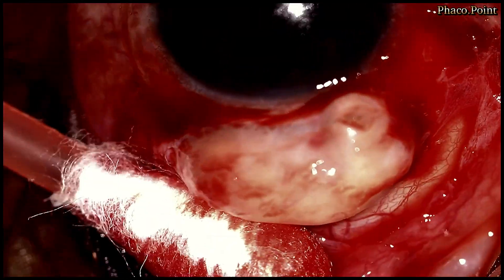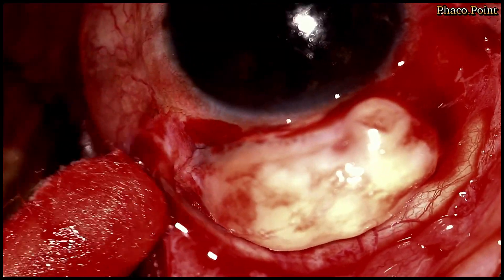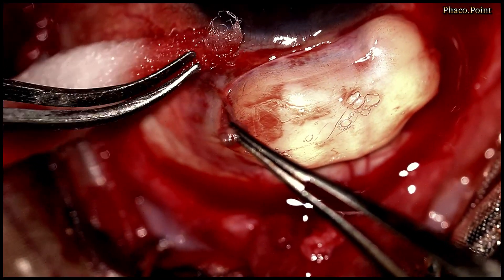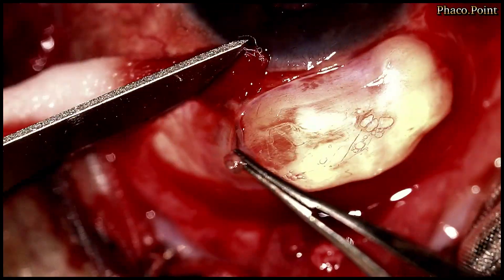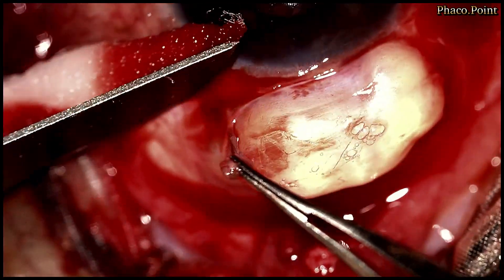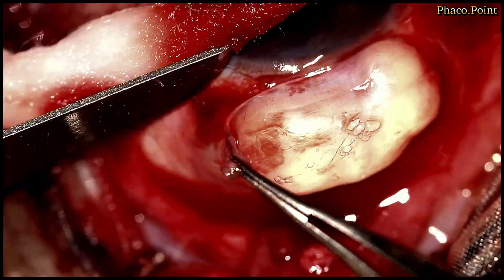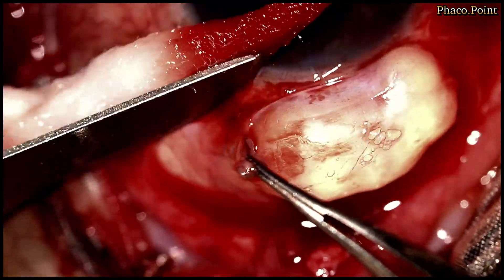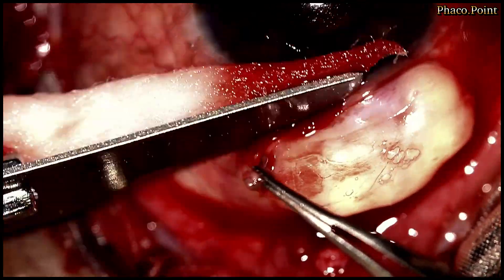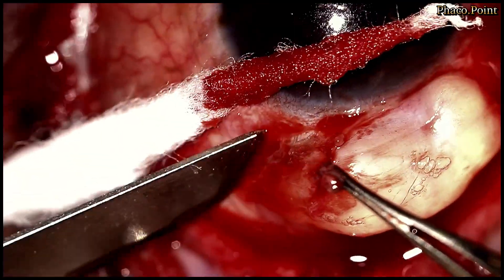Following the completion of the dissection, you can actually see the entire cyst now exposed. It is clearly firmly adherent at its base. We now move to dissect the cyst off the surface of the sclera. I do this with the help of a 15-number blade, and as I proceed with the dissection of the cyst from the surface of the sclera, notice what I see.